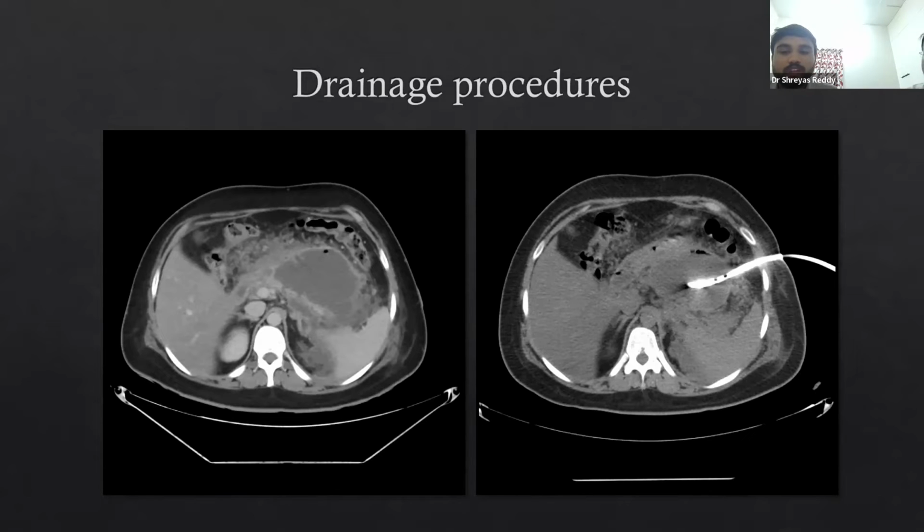Okay, then what has been performed for this patient? Here we have performed a pigtail catheter placement within the infected collection. Yes. Under CT guidance. Why do you choose CT guidance for this patient? As you can see that a colonic bowel loop is very close, just superior to this collection. So under ultrasound, that would be interspersed between our area of interest. Yes. So therefore, CT is better. Yes, it's a retroperitoneal collection, which is closer to the air in the bowel, and so might be difficult for us to visualize by ultrasound. So we have chosen a CT approach.